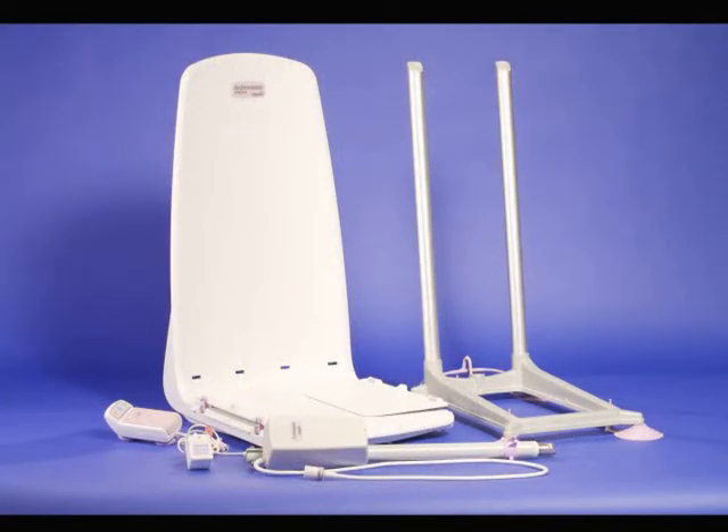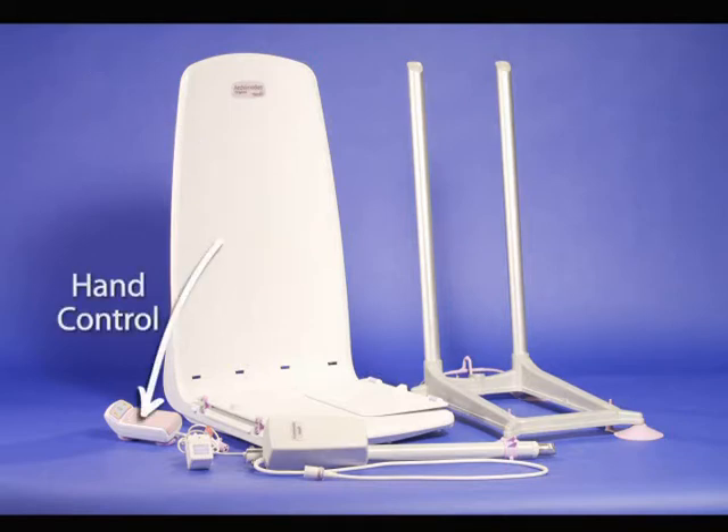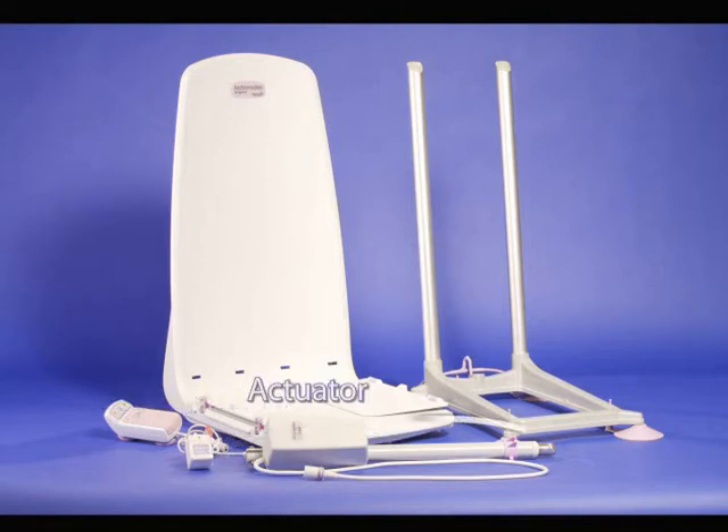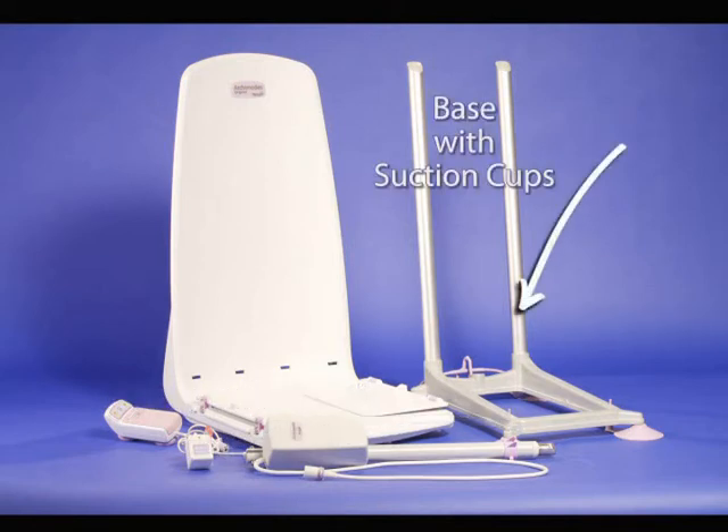The Archimedes can be disassembled into the following components: the one-piece seat and back, hand control with self-contained battery, battery charger for hand control, actuator assembly, and the base with suction cups.